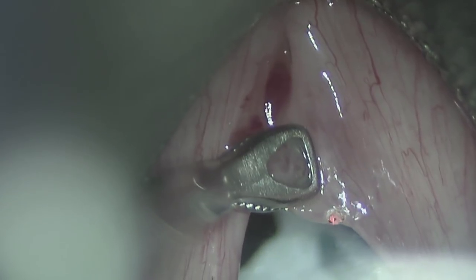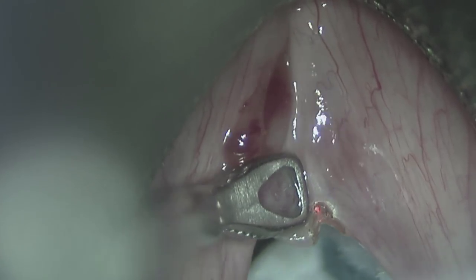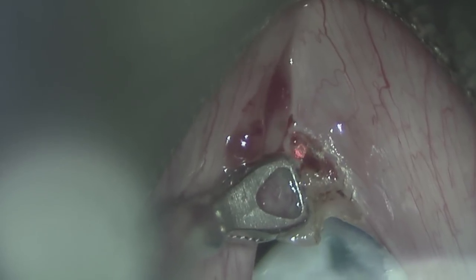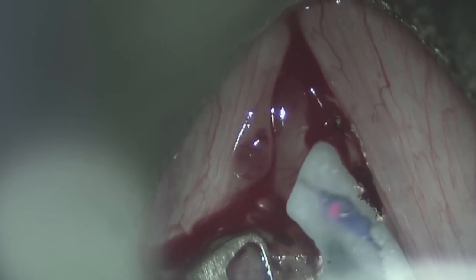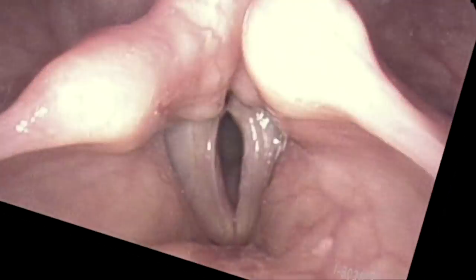At this time I had an older laser — it wasn't programmable, so it fires a single spot at a time. I use the laser to cut through the tissue. When it hits the blood, there might be a little char or blackness, or a bit more of a burn. We want to avoid the burn because heat causes stiffness afterwards, though I can also use it to stop the bleeding. The important thing is: how does he do? How flexible are the vocal cords? Do they come together? Have we gotten rid of the double pitch and roughness?